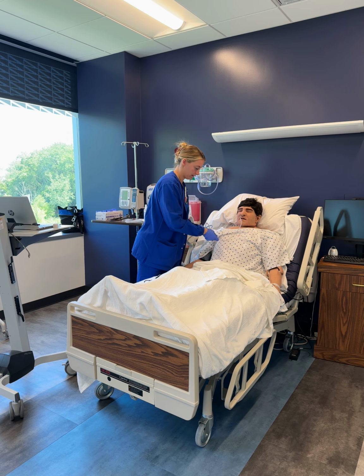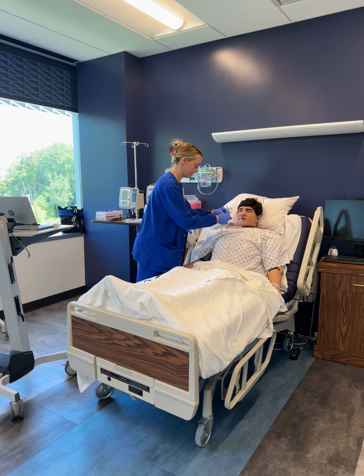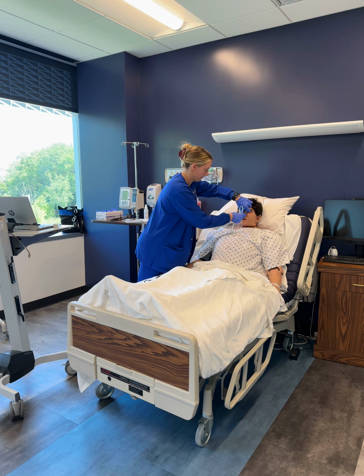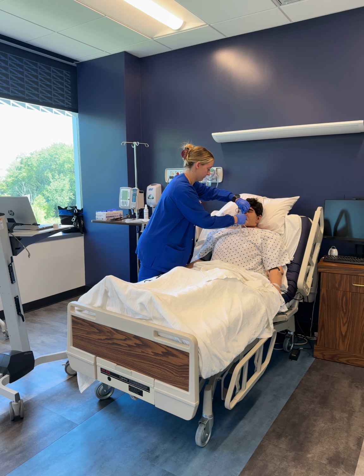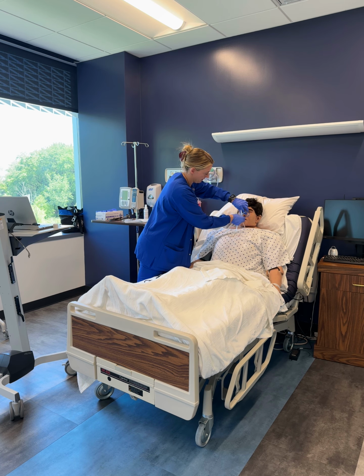We're going to go all the way down till there's about 10 left. So we had 55, so we're going to go to 65. At this time, I'm going to use my split tape on the bridge of the nose. It's not going to stay on this patient, it's just not adhering to him, but I am taping it. I'm going to then apply tape to the bridge of the nose to keep it attached.